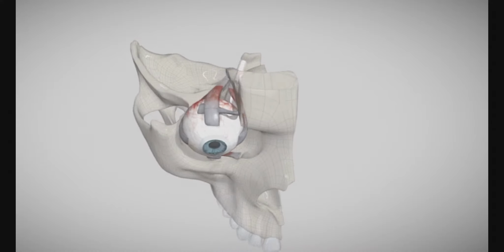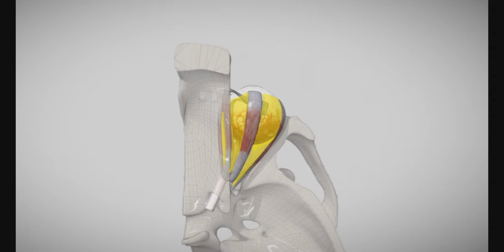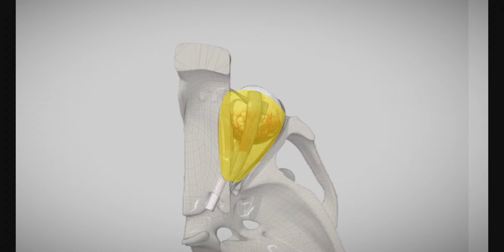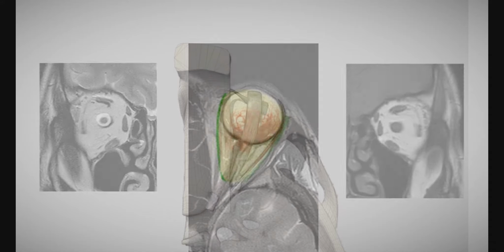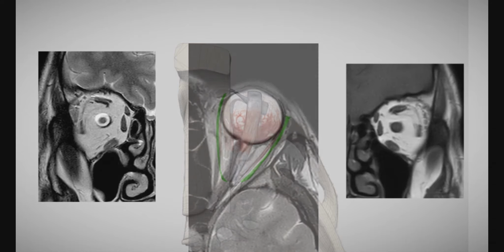The location of orbital structures is best understood by dividing them into different compartments. Intraconal space. It is the space surrounded by the four recti and intermuscular connections, housing the optic nerve and its sheath, seen best on axial view along with add-on coronal views. Extraconal space. Best visualized in coronal sections, this is the space between the muscle cone and the periosteum of the orbital wall and anteriorly limited by the orbital septum. Subperiosteal space. It is the space between the periosteum and the bony orbital wall, which requires all sections for optimal analysis.